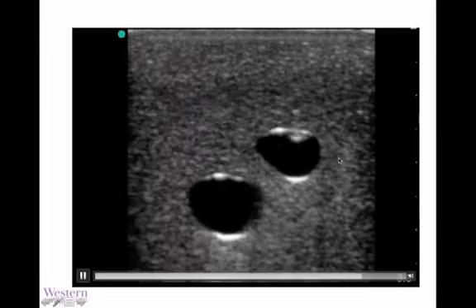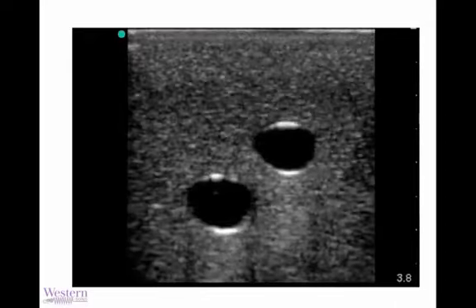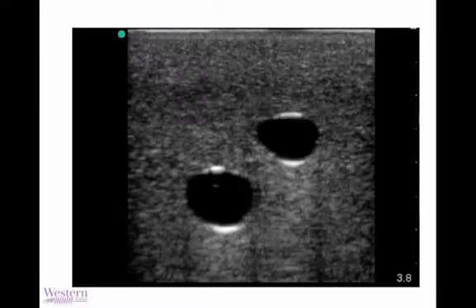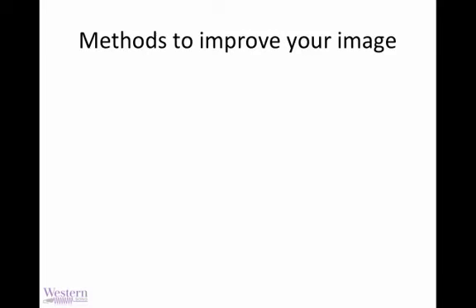And we know it's the tip each time because each time the operator moves the ultrasound beam beyond the hyperechoic spot just a little bit, and each time slides the needle back into the plane. So this is really, really expert stuff, and what I hope all of you can achieve.